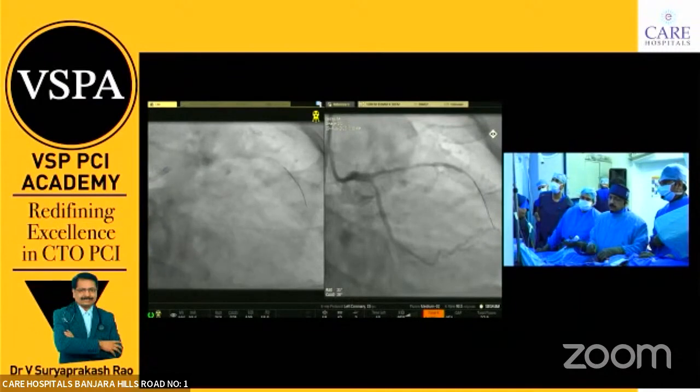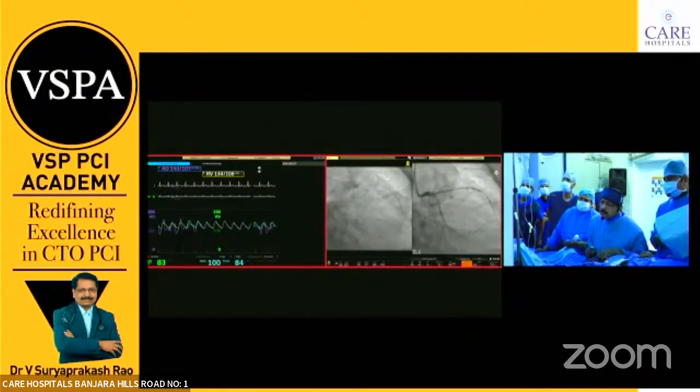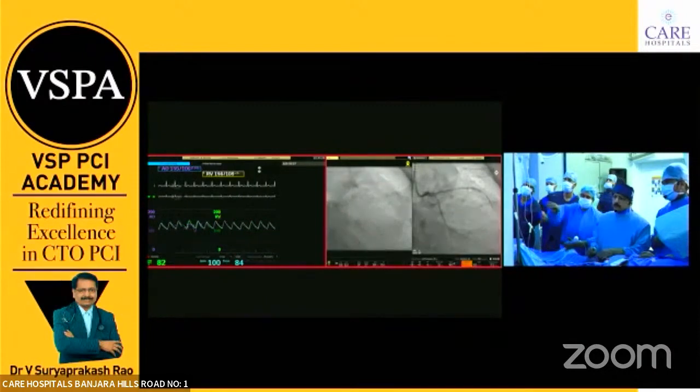That is the overlap. Okay. The two stents and the proximity to the overlap. Exactly, you do it here.